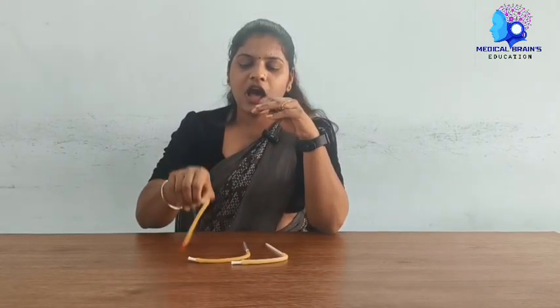The first one is the RBC pipette, and it is used for the red blood cell count. The second one is the WBC pipette, and it is used for the white blood cell count. And the third one is the Hb pipette, and it is used for the estimation of hemoglobin.